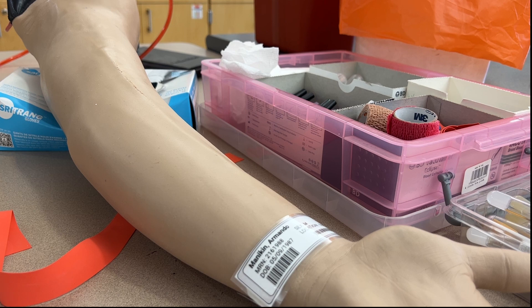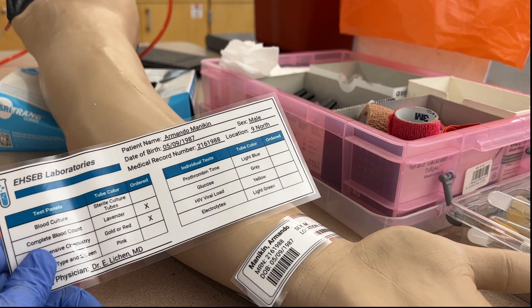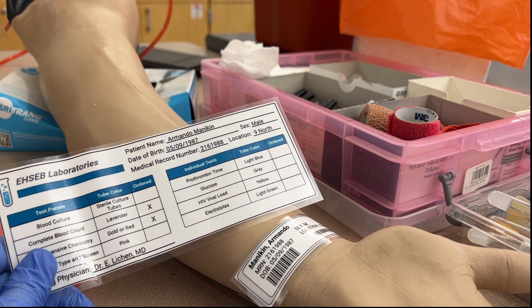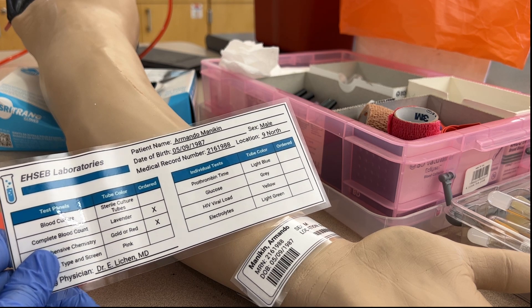However, if the patient does not have capacity we can compare the information on their armband with the information we have on the requisition slip. For this patient his name is Armando Manikin, he has a date of birth of May 9th 1987, and a medical record number of 2161988, and we can compare that information from the requisition slip and the armband and see that everything matches.